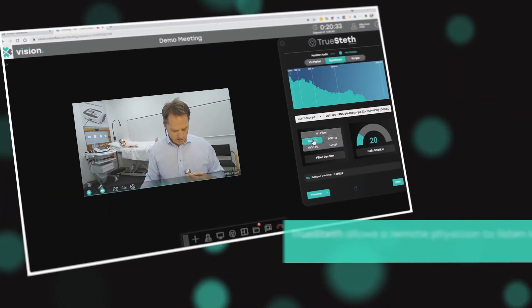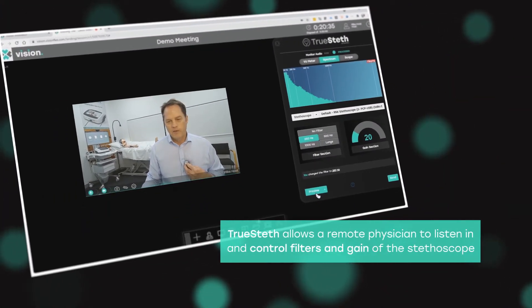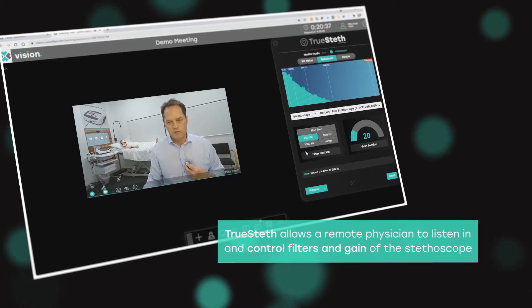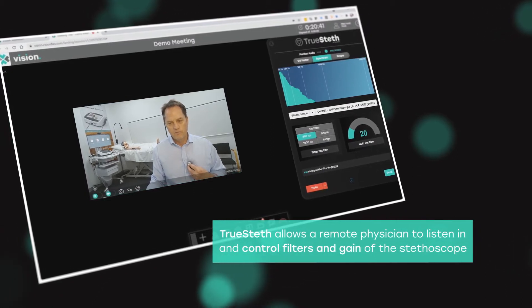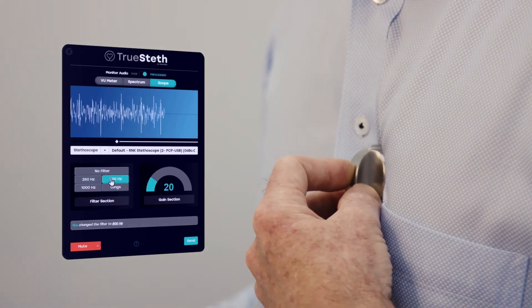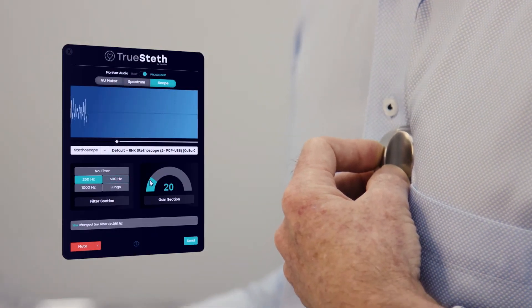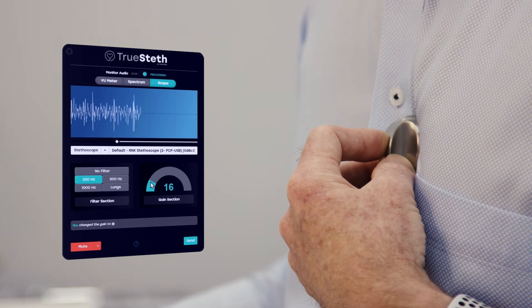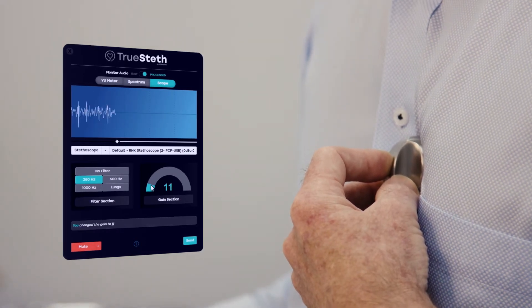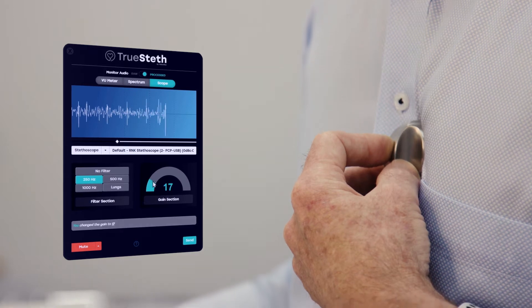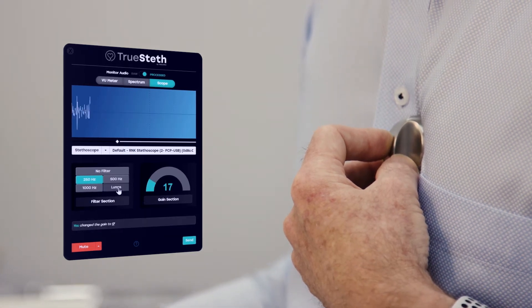Mike here from VisionFlex with a quick overview of our TruSTETH digital stethoscope feature. TruSTETH allows the remote physician to take control of the examination and to control the gain and the filters being used by the stethoscope. The consulting cardiologist can then look at the graph coming through, hear the sounds in the original format so there's no distortion, no loss of audio quality, and they also have control of the filters and the gain of the stethoscope.